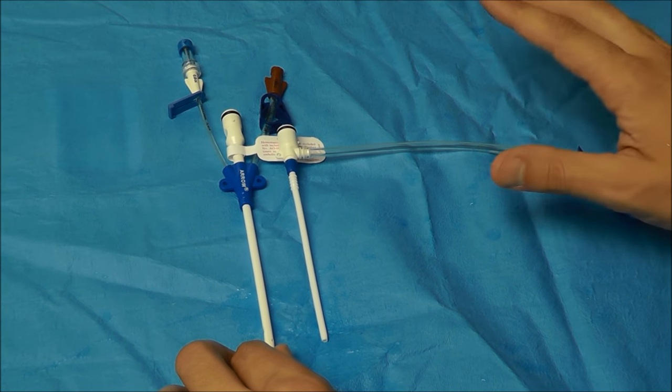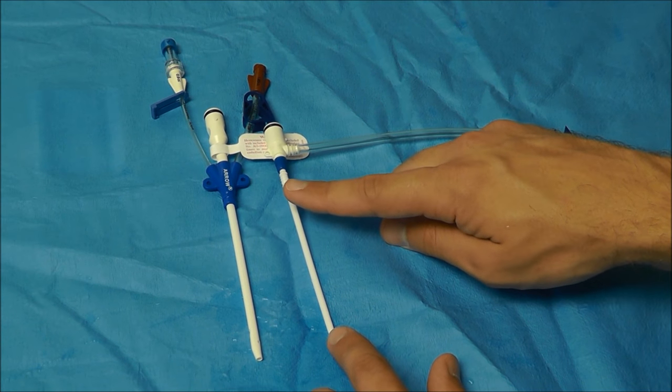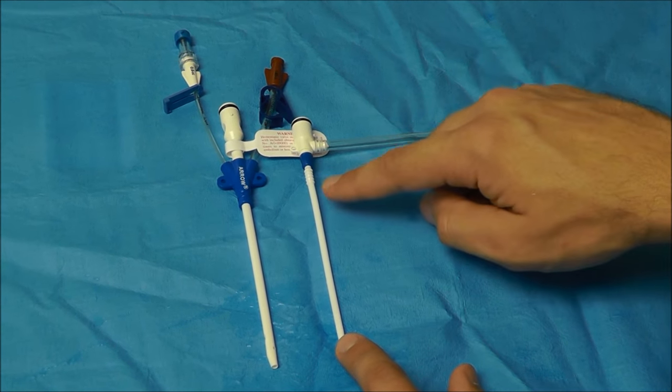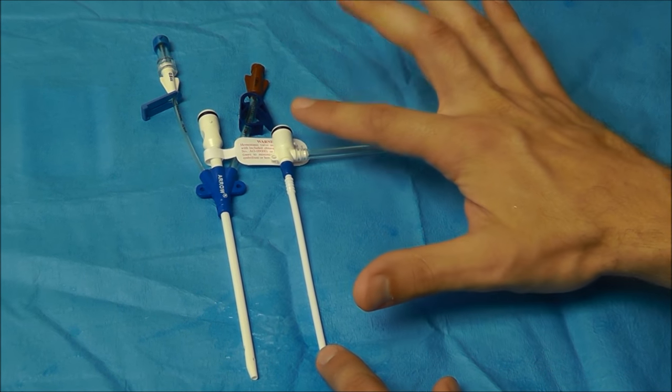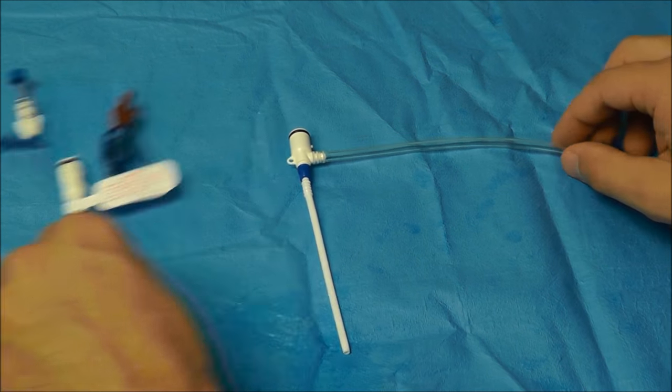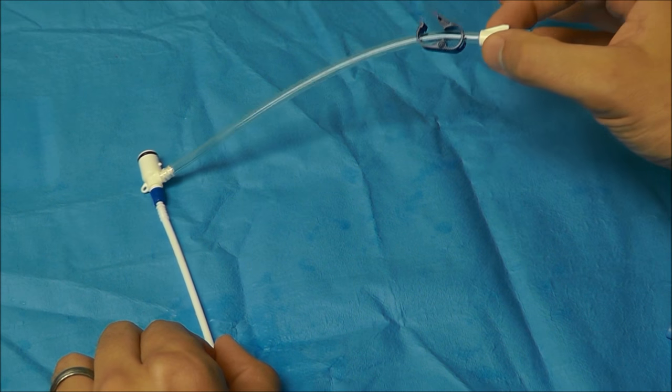But the other advantage is that it can act as a conduit for something like a pulmonary artery catheter. The disadvantage to a line with an introducer port is that they usually have less lumens. For example, on the 8.5 French cordis you can only run fluids.